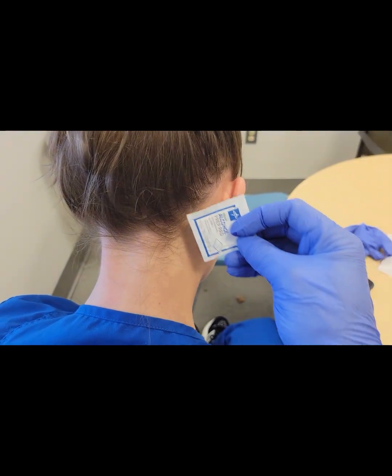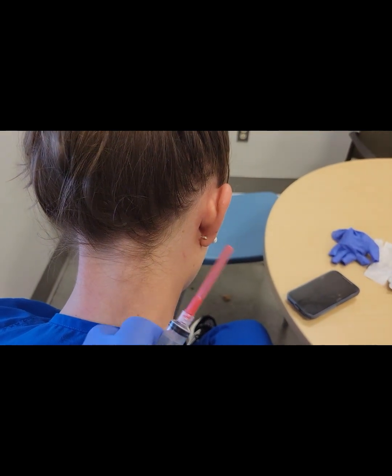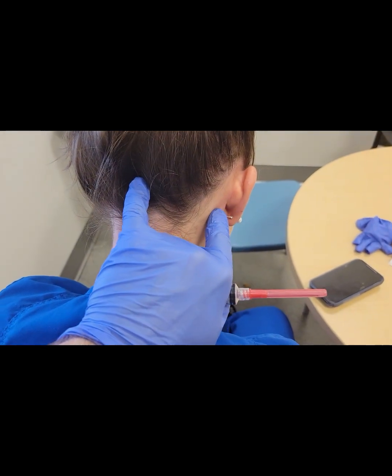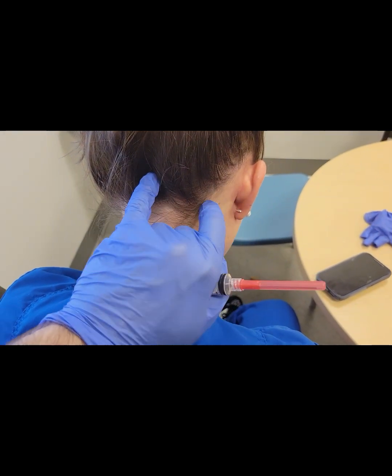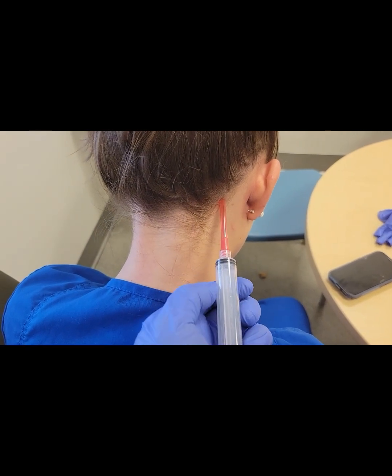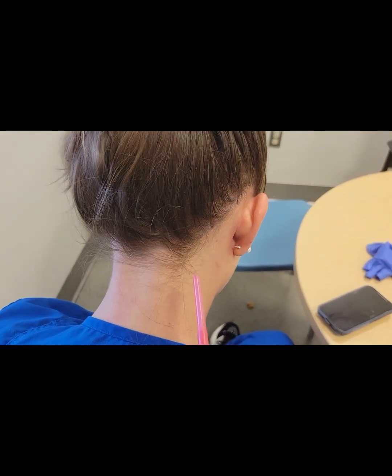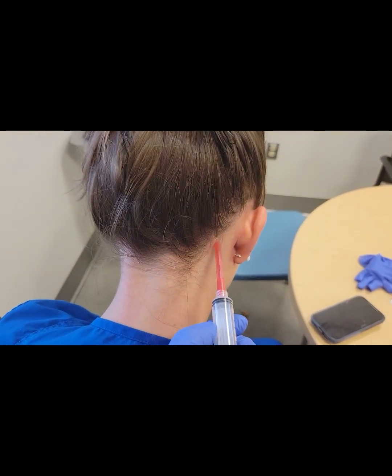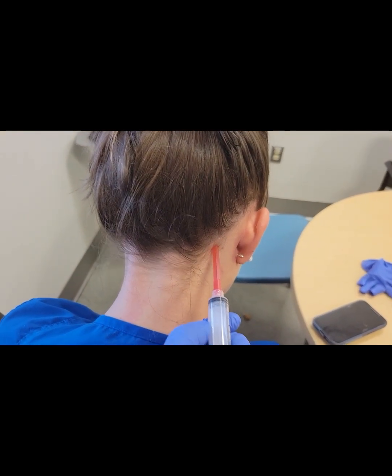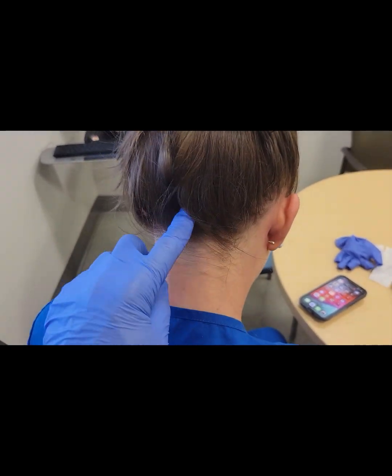Locate your landmarks. Find the occipital protuberance and move inferiorly 3 cm, then laterally 1.5 cm to the left or to the right. As an additional approach, you can find the occipital protuberance and the mastoid process, draw a diagonal line, and move one-third of the way laterally. Mark these areas as the injection site.